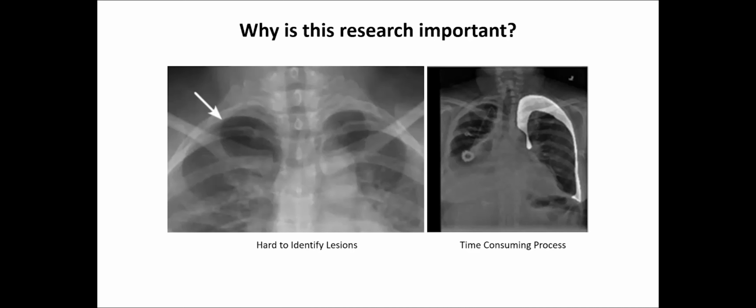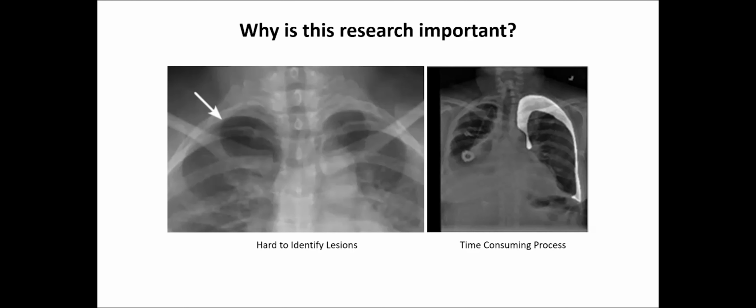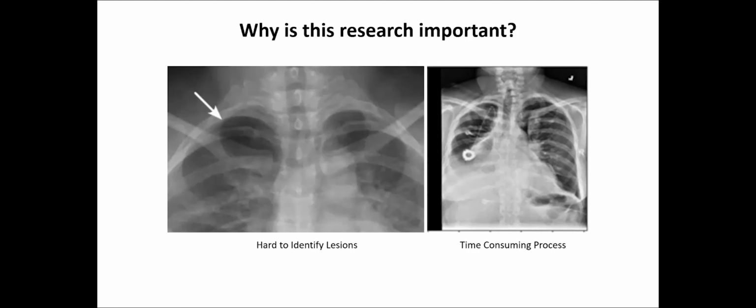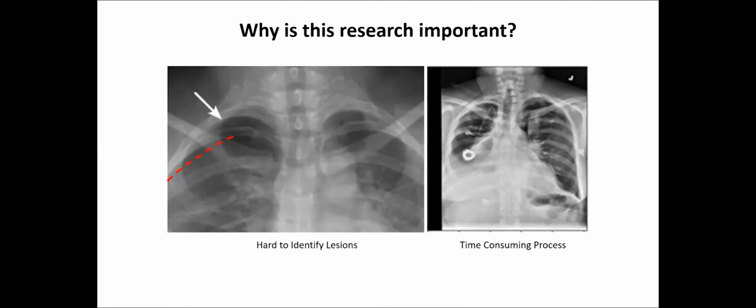And it is very hard for physicians or doctors to observe with their eyes, needless to say for us who are not experts in such a medical field. So as you can see here, that's where the pneumothorax happened. And clinically, the doctors are trying to find the location of the air or fluid inside.